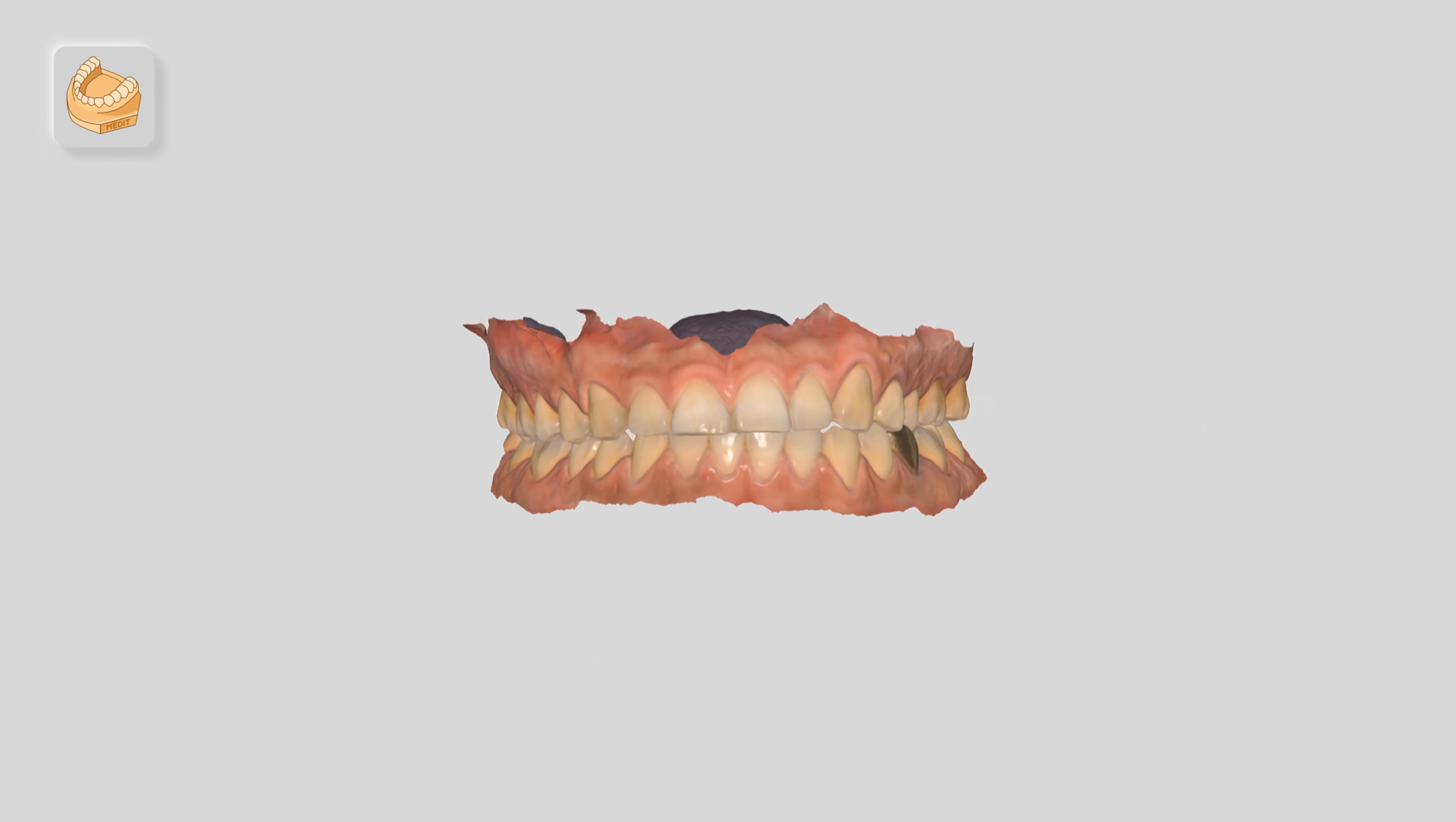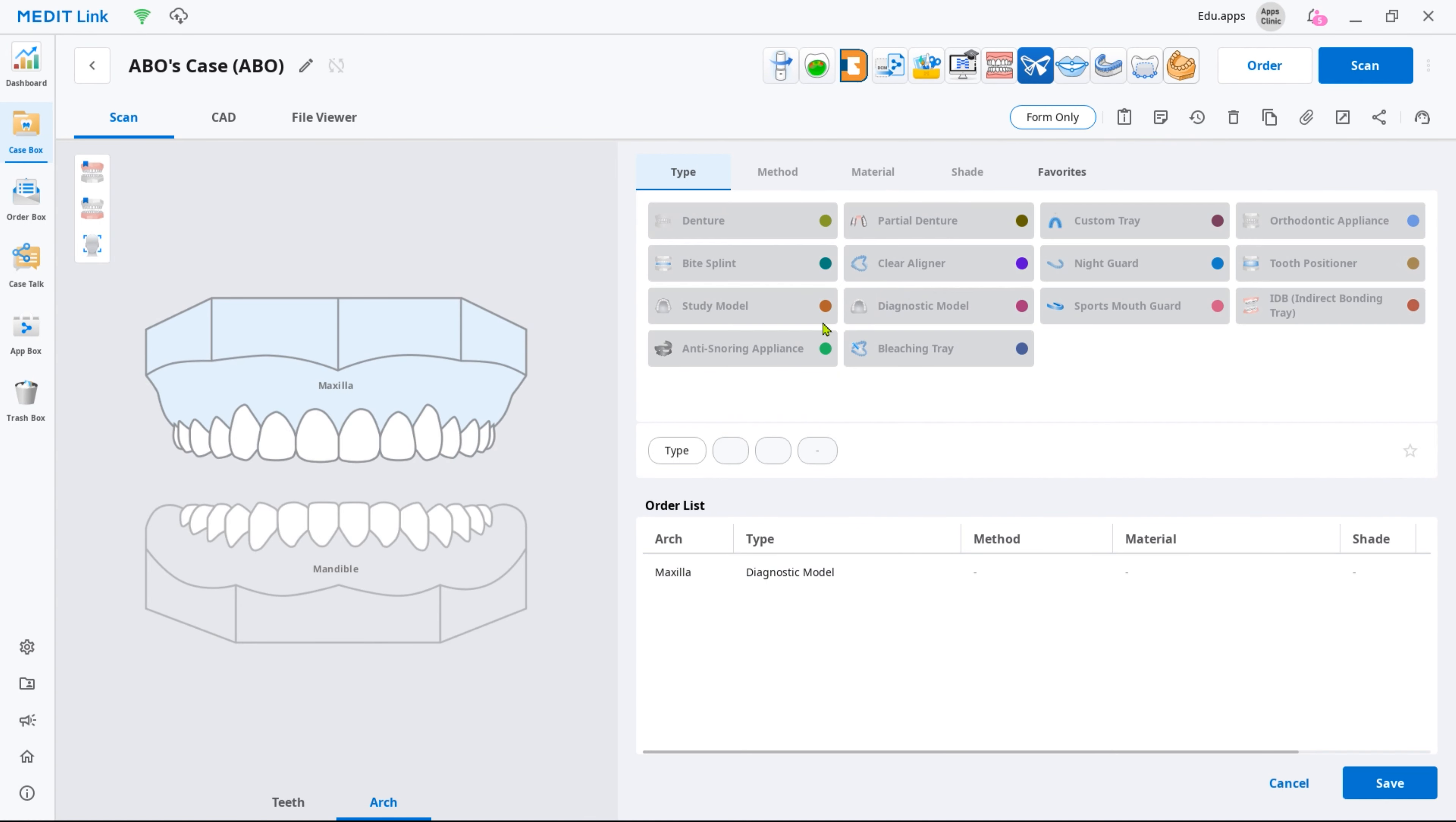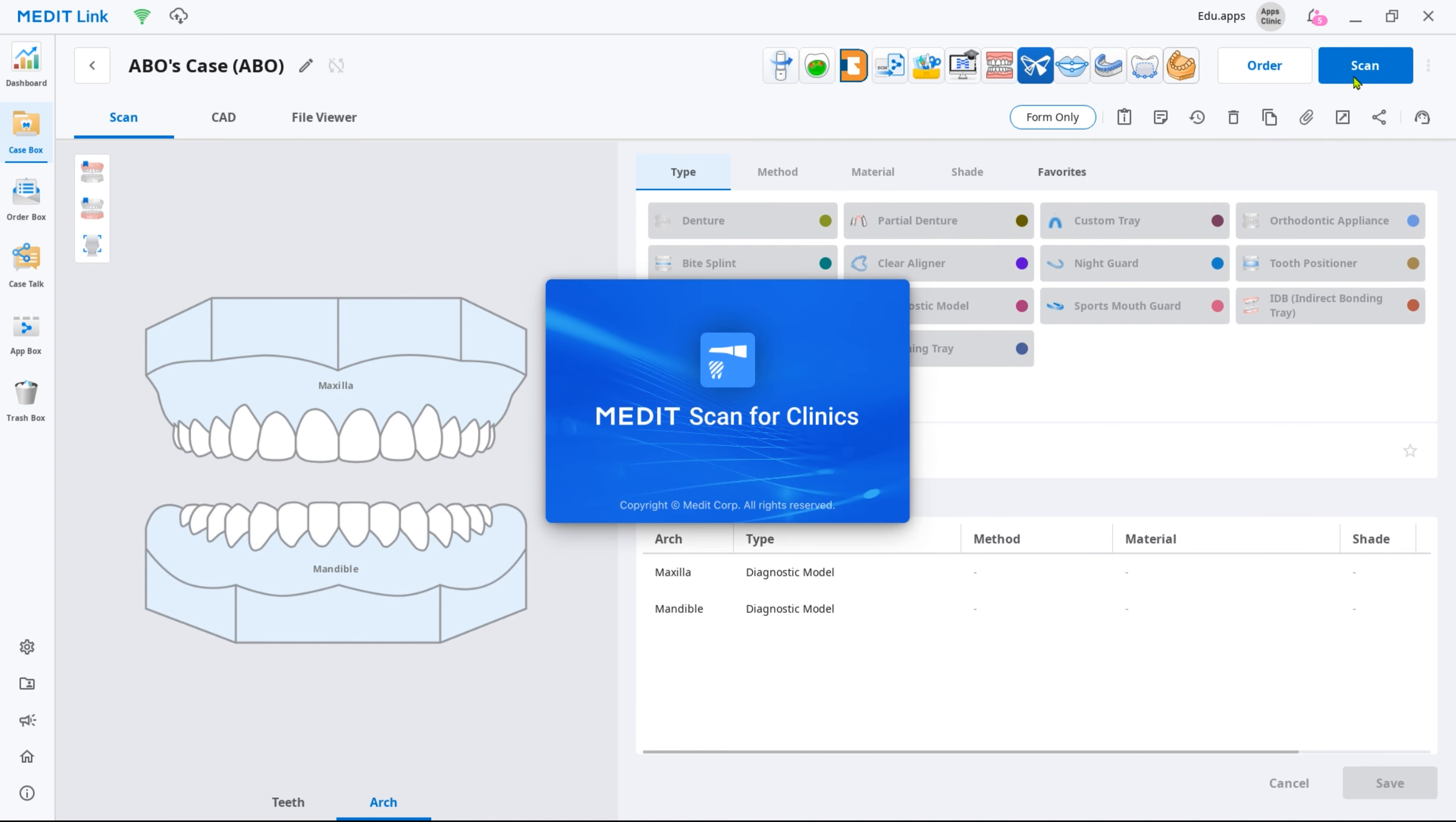You will need the scan data to work in the app. Create a new case, select Diagnostic Model as product type in the form, and then scan both arches.